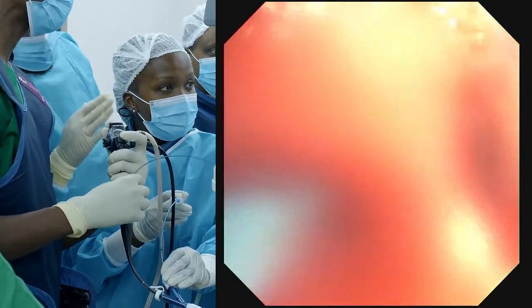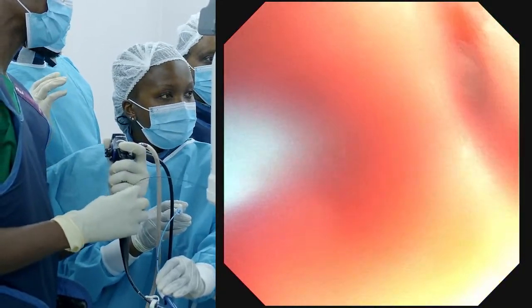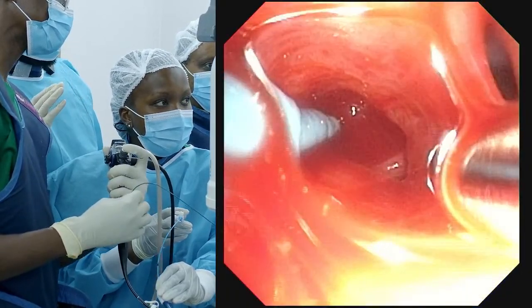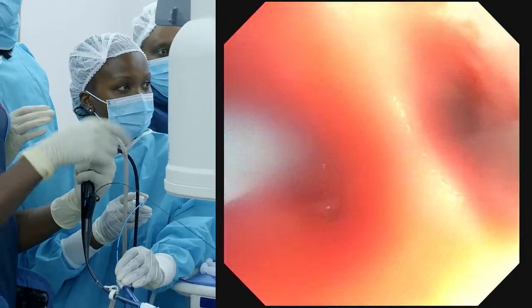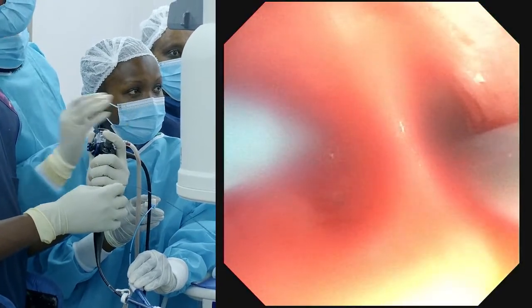It's okay. Just follow when the probe comes out of the end. Then use fluoroscopy now. And that's why I like the continuous setting, because it makes it easier for me. First flip it. Okay. Now I'm going lateral. I decided to go lateral. So you have to make sure the balloon doesn't go too deep.